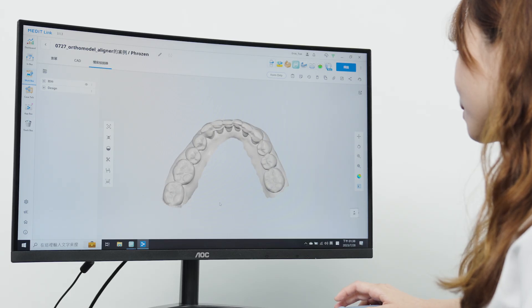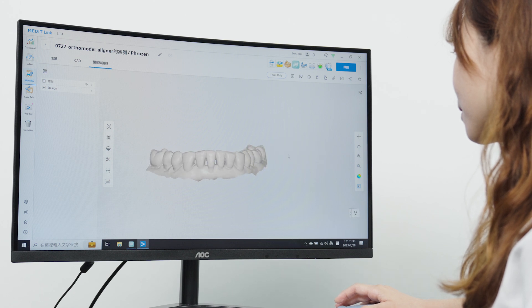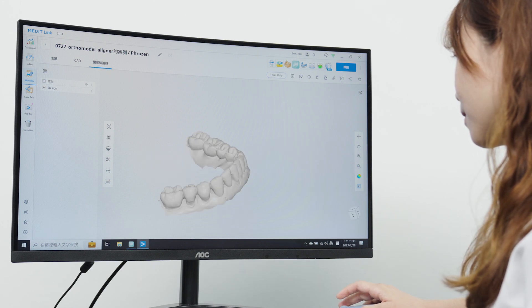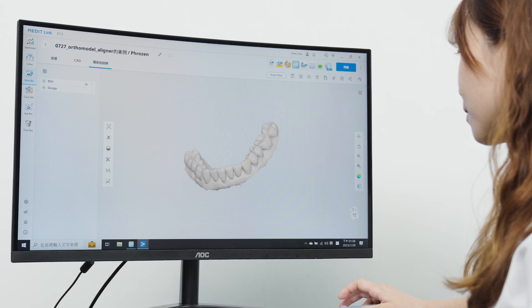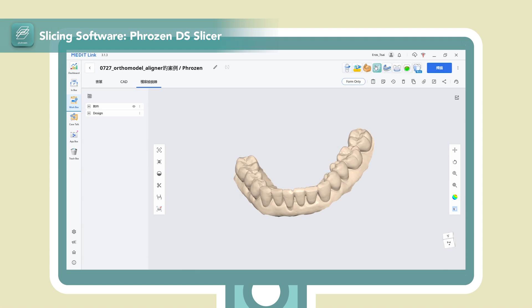We can see the digital impression inside the CAD software. Then we will use FrozenDisk Slicer to turn this scanned data into a ready-to-print file. The CAD software allows you to directly send the scanned data to FrozenDisk Slicer.